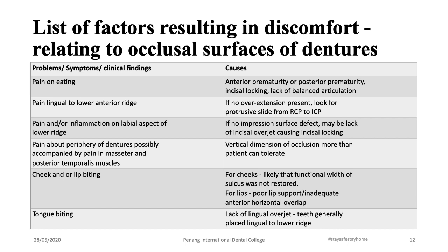So when that is happening, there is more force acting on the upper denture at the anterior surface, and the flanges are putting more pressure onto the sulcus or onto the ridge area. So when this happens, you might have to rectify by trimming the incisal edges so that there is no contact happening.